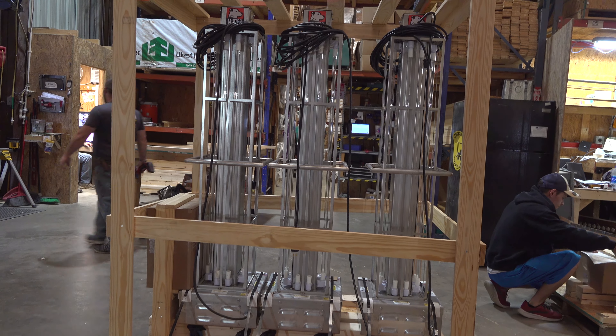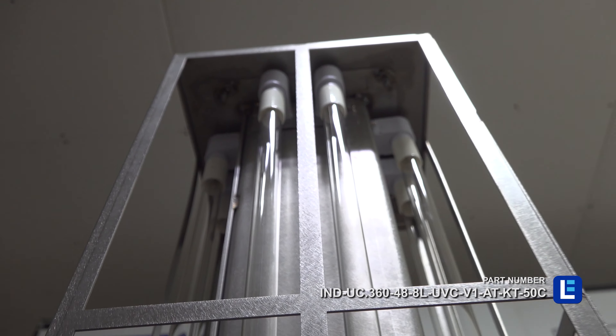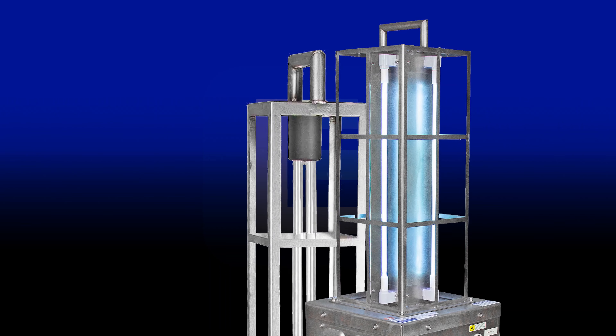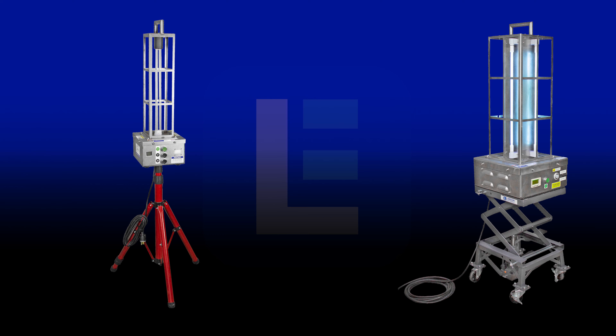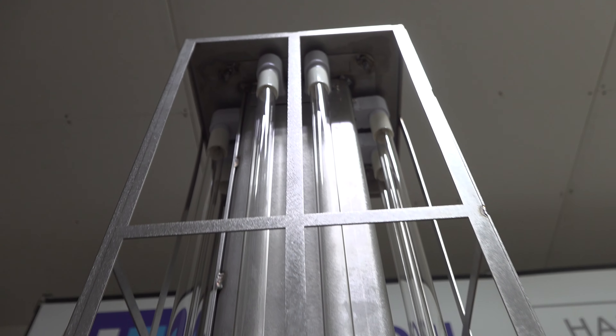Larson Electronics offers different types of UV disinfection carts that cater to specific sanitation requirements, room configurations, and cleaning methods. Models mounted on tripods are suitable for cleaning hard-to-reach and upper areas of rooms. Battery-powered UV carts ensure a wireless experience with greater flexibility.